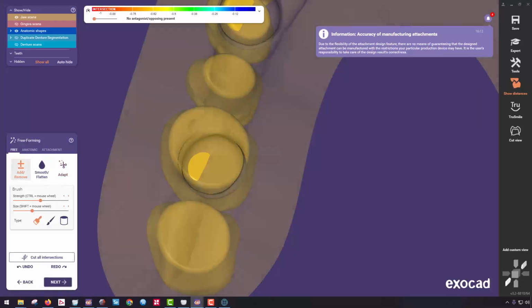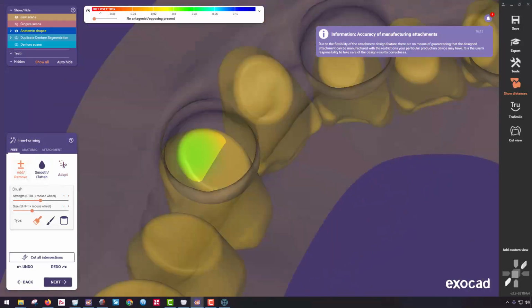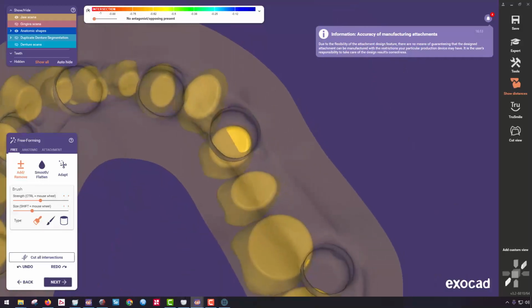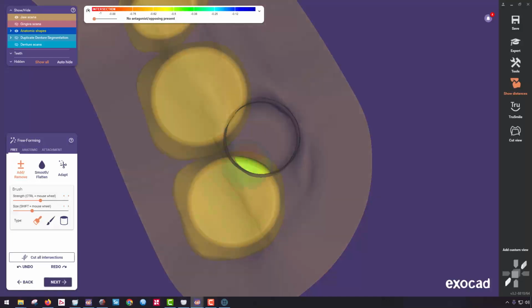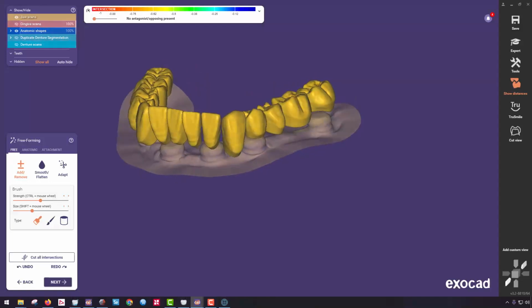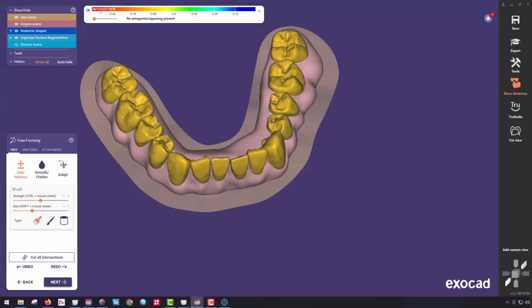Just for good measure, I like to go ahead and manually sculpt these away from the intersected areas. So if you see any of that darker color sticking through, I'm just going to go ahead and bring my push and paint tool right in here, shrink that away. I find it works better, everybody. So I'm just going to get rid of that from my scans, and that way it doesn't get hung up. Doesn't change the aesthetics of it. It's still pretty much exactly the same denture. Verify that nothing has changed. Great, hit the next button.